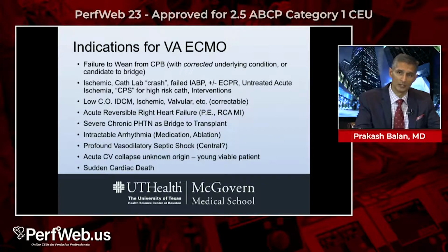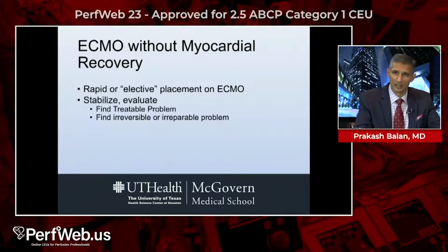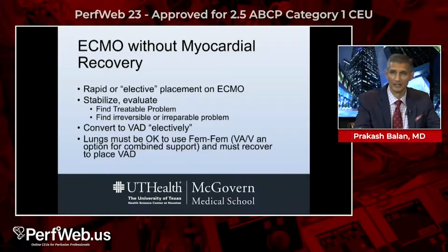Sudden cardiac death, as I mentioned, is a big part of what I do, and ECMO certainly can help under these circumstances. In terms of what you're trying to accomplish with ECMO, rapidly getting the patient on hemodynamic support allows you the platform from which to stabilize and thereby find and correct the underlying cause of the shock state. Conversion to a permanently implanted ventricular assist device can be done electively once you have that stability.